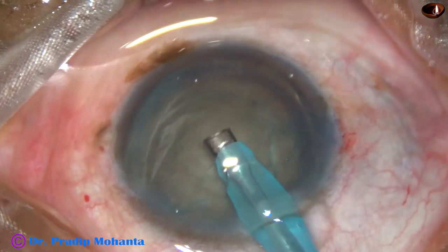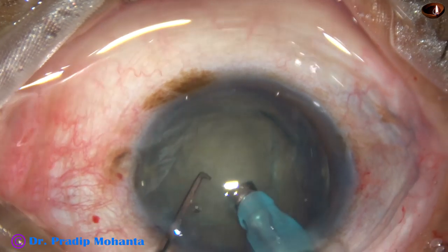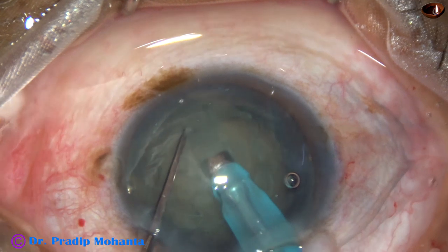And now the handpiece is turned, bevel is up. And now I start sculpting. This is the trench, the first trench.